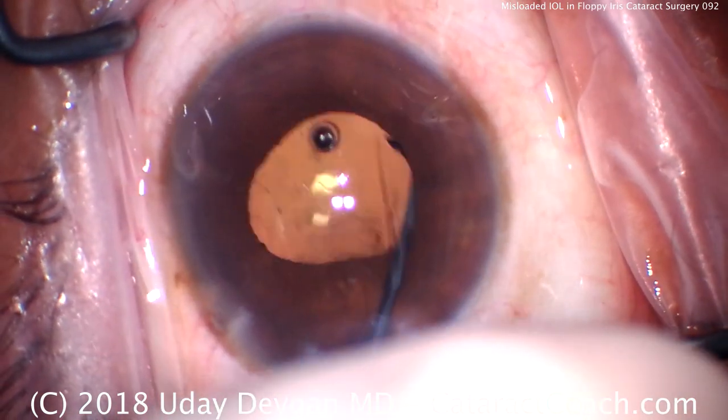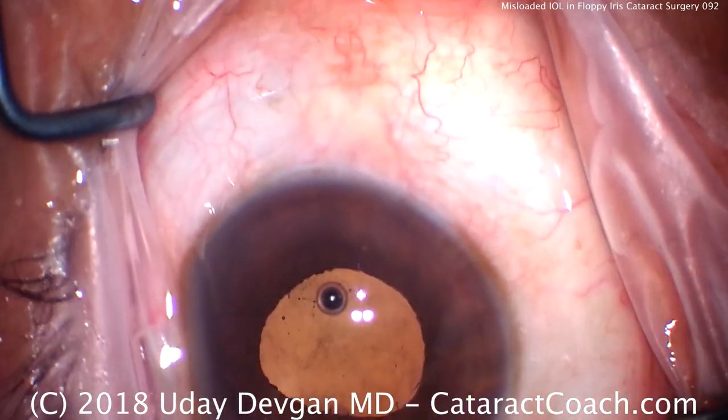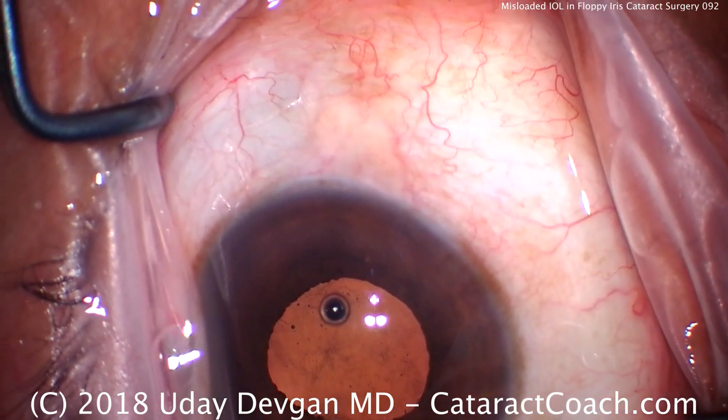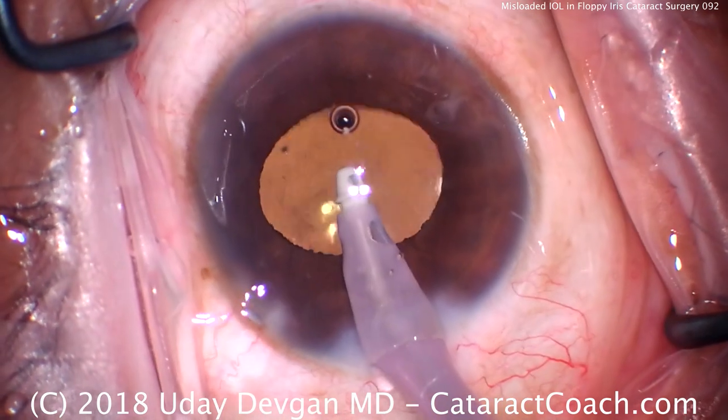That looks great. Rotate the lens into position and we'll ensure that the lens is completely in the capsular bag. We'll remove the viscoelastic.